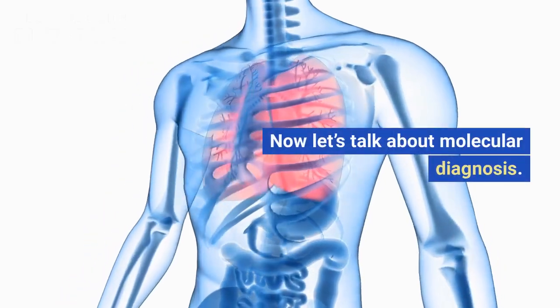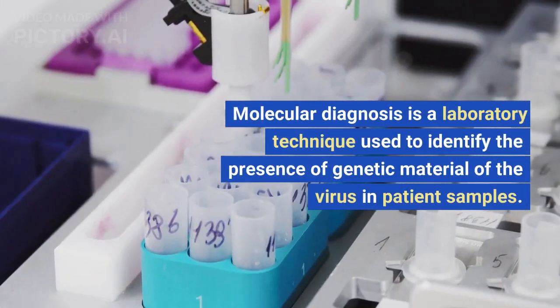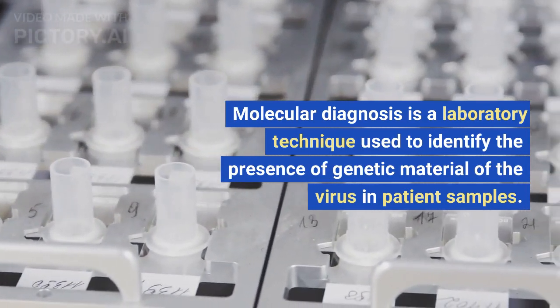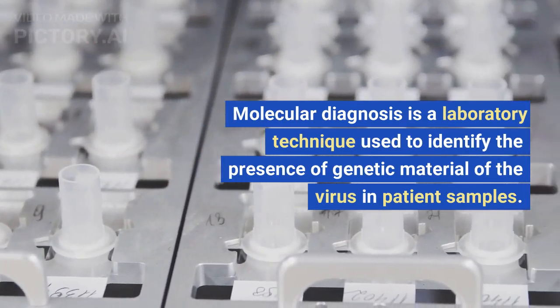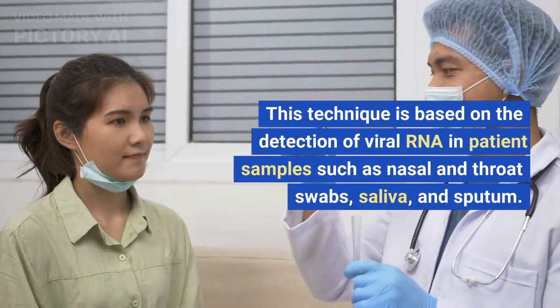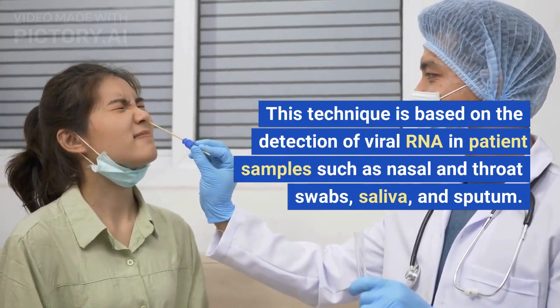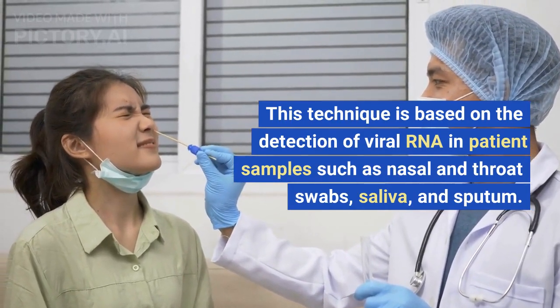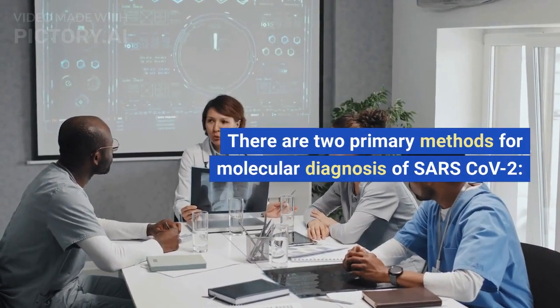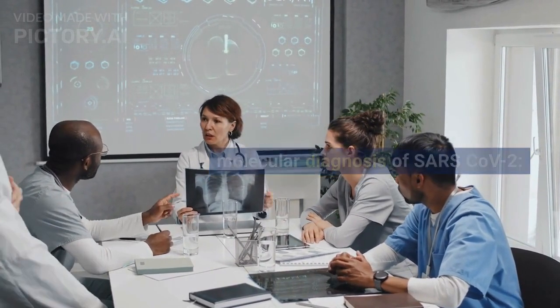Molecular diagnosis of SARS-CoV-2. Now let's talk about molecular diagnosis. Molecular diagnosis is a laboratory technique used to identify the presence of genetic material of the virus in patient samples. This technique is based on the detection of viral RNA in patient samples such as nasal and throat swabs, saliva, and sputum. There are two primary methods for molecular diagnosis of SARS-CoV-2.